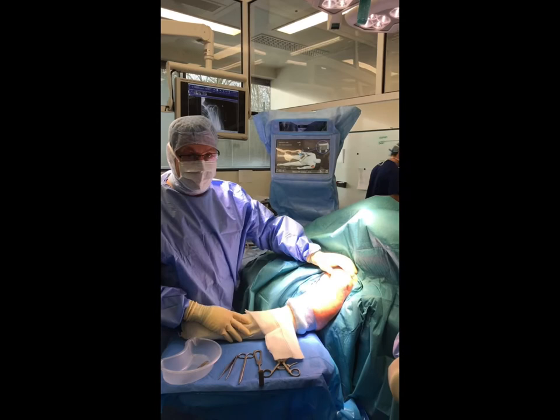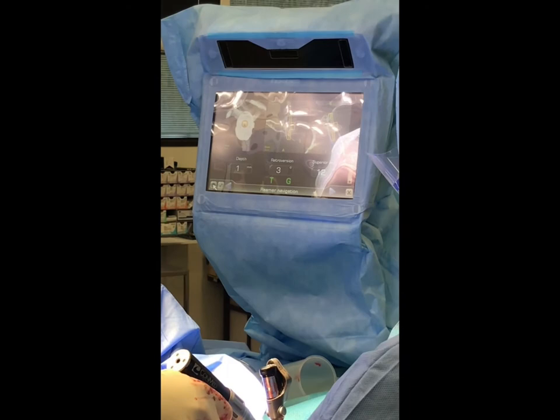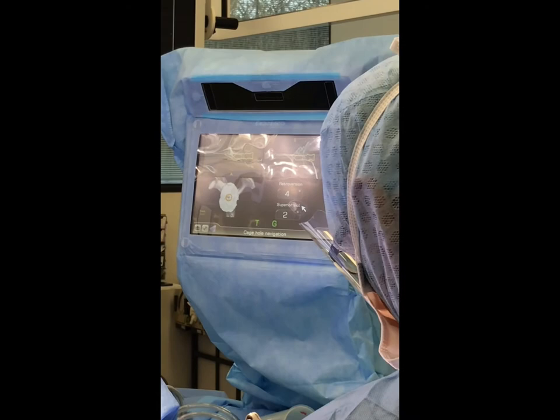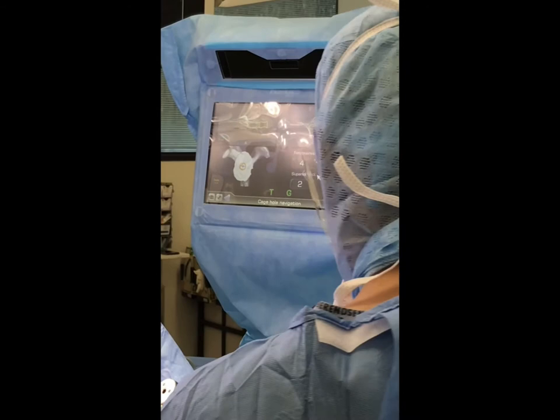And now you can see we're using the navigation to help us insert the guide wire, not only with the correct entry point, but also in the correct version and tilt. Now, after having reamed the glenoid, we're using the navigation again to help us drill the central peg hole in exactly the desired orientation.